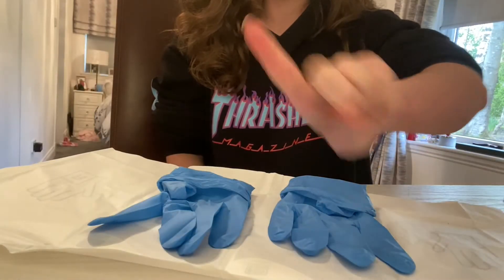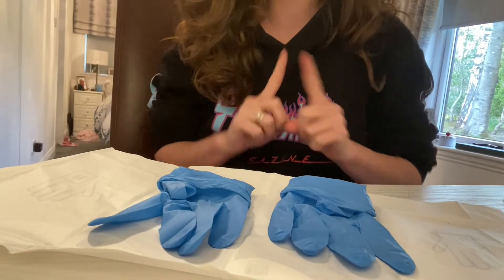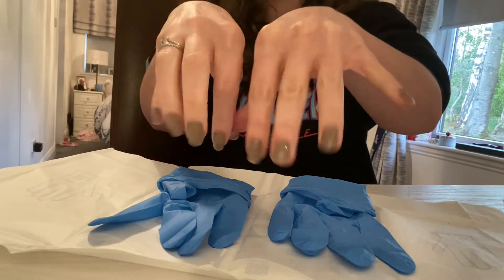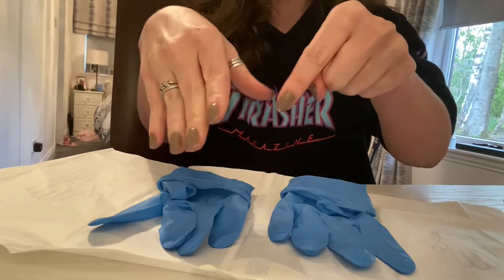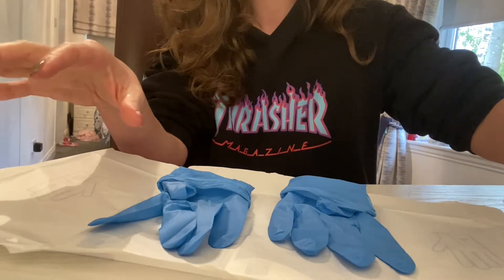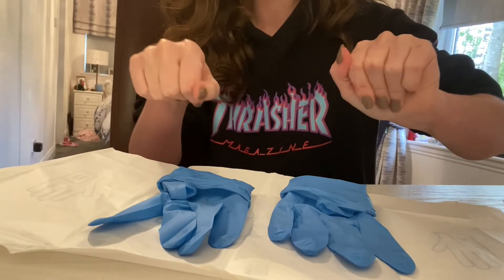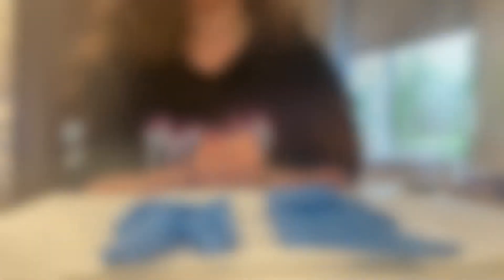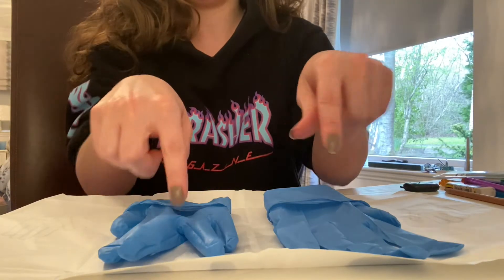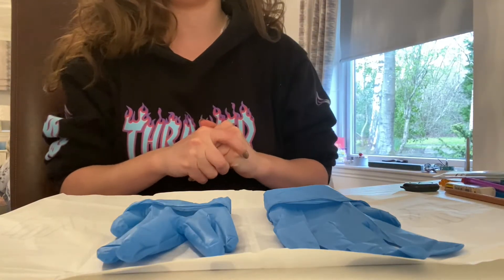Technique number one: open gloving. I've got my gloves laid out in front of me. Just remember, in the real world I wouldn't have any nail polish or jewellery on — I should probably take those off as this is turning into more of a 'what not to do' than a 'what to do.' I've got my left glove in front of my left hand and my right in front of my right, with both fingers facing forward.